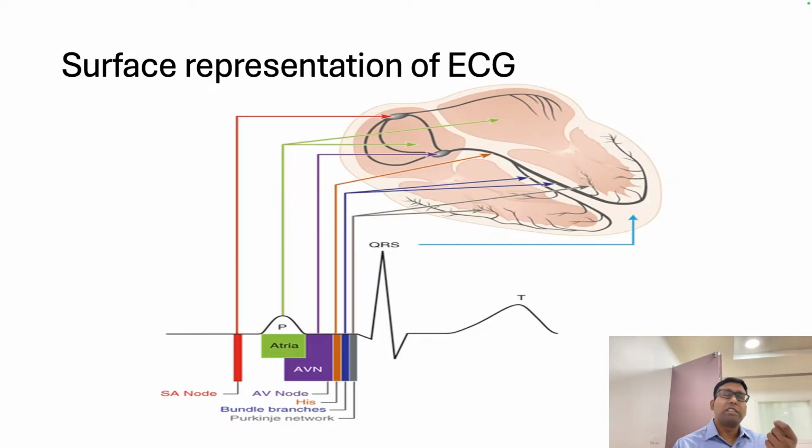Before the atrium, what is activating the atrium? SA node. So with the SA node, can you see the signals of sinus atrial node activity in the ECG? It is indirect. Whenever you are getting a P wave, it is thought that probably the sinus node is activated first, and that's why the P wave is coming. Whether you are seeing the P wave of right atrium or left atrium.